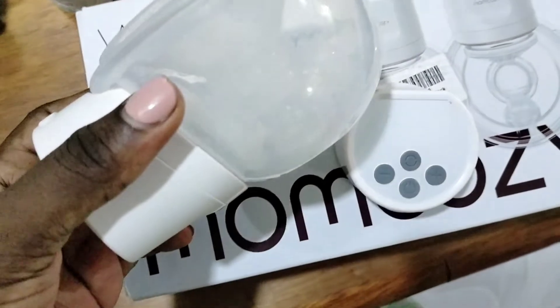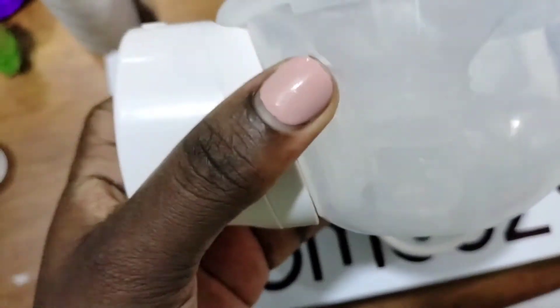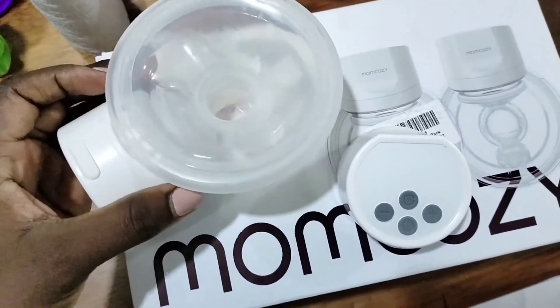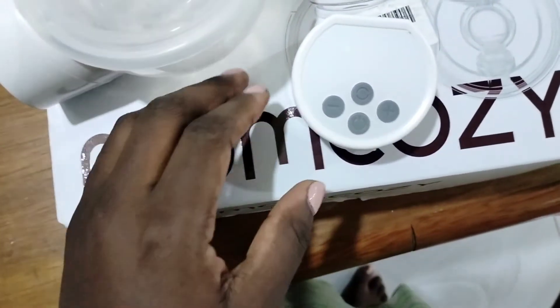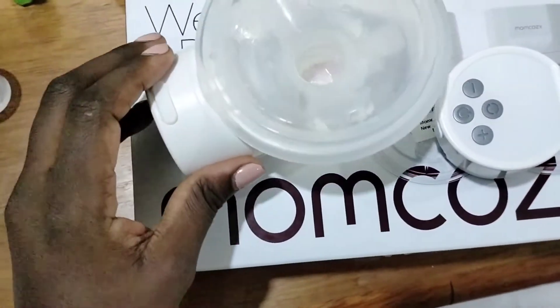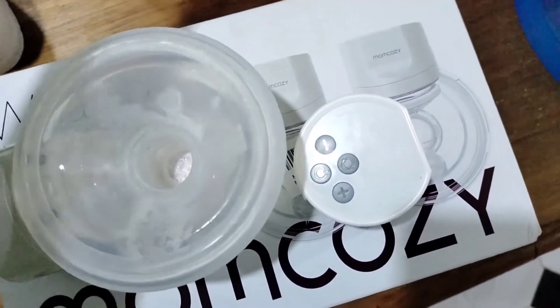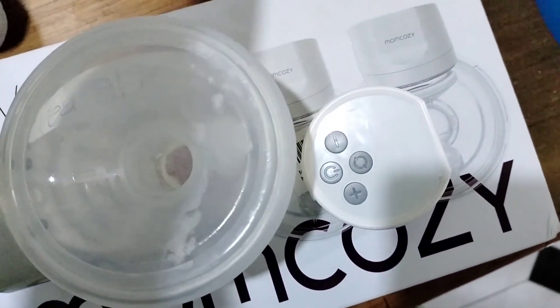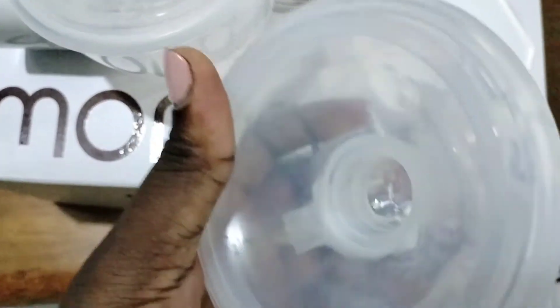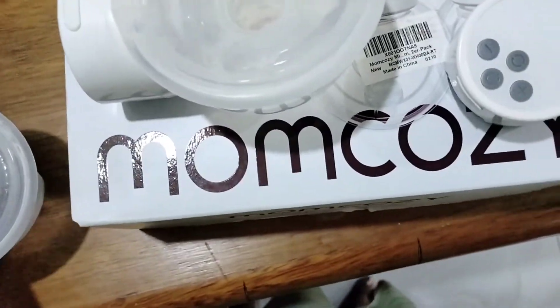I don't want to turn it upside down because I just emptied the milk I had pumped from inside — I just wanted to show you how it is. It is fitted here on this side. Let me show you how the other one looks like, the other parts. This is the part that you fix on — this part is the one that you fix the motor onto.